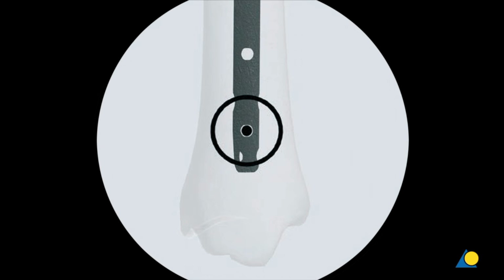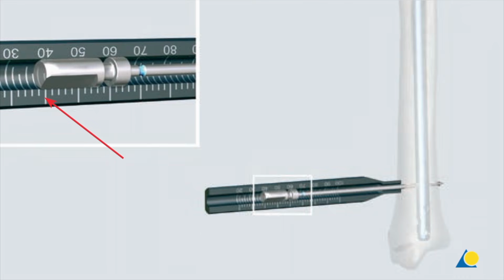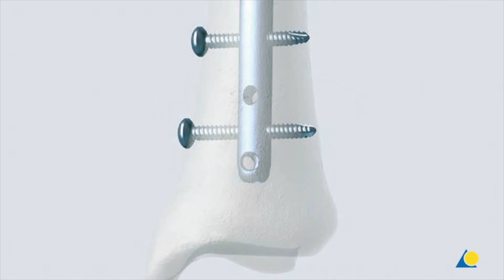After confirming the correct position of the drill bit beyond the far cortex, the radiolucent drive is detached. The direct measuring device is slid over the drill bit, and the appropriate length for the locking screw is determined from the measuring device at the end of the drill bit. The appropriate length locking screw is inserted using the screwdriver star drive T25 and the holding sleeve if needed. The screw length is verified under image intensification. A second locking screw may be inserted using the same technique.